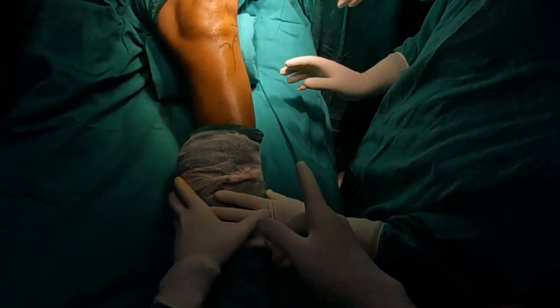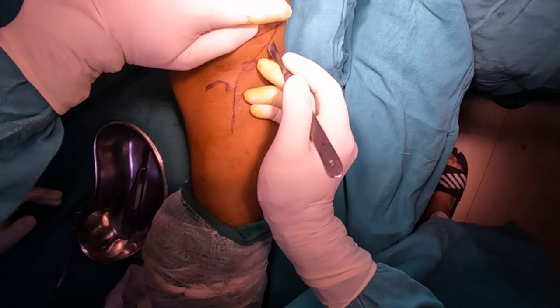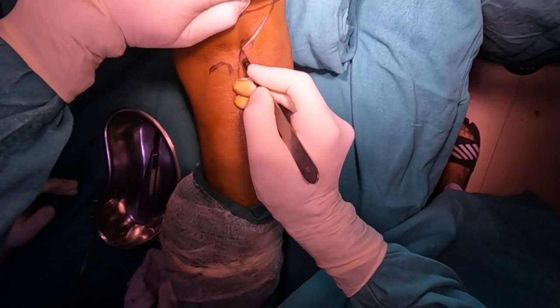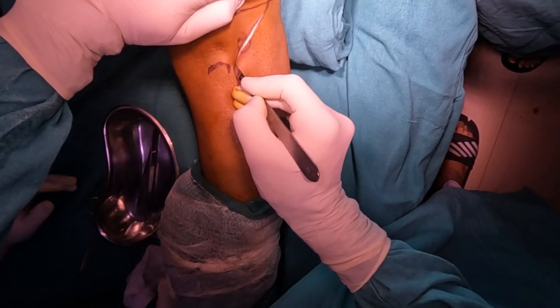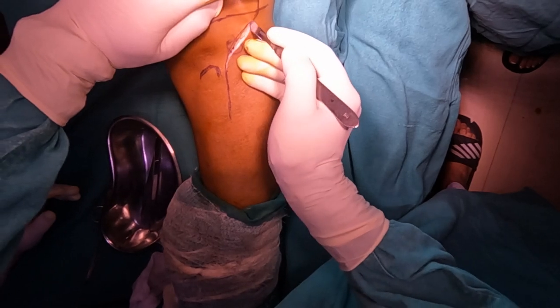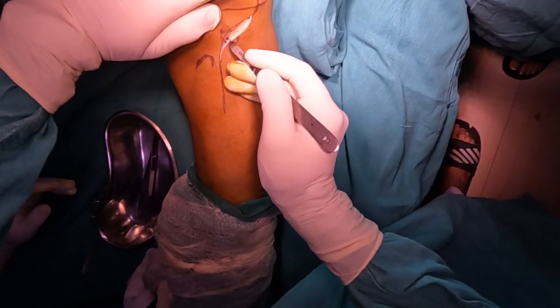However, since this is a pure depression fracture that we plan to reduce and fix using a raft screw only, we are utilizing a modified limited approach, focusing inferior to the joint line that goes through Gerdy's tubercle and exposes the lateral proximal tibial metaphysis.